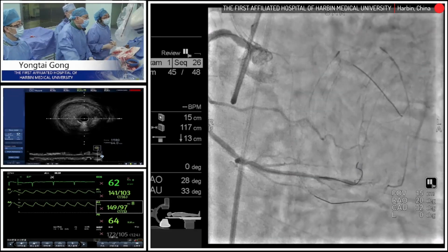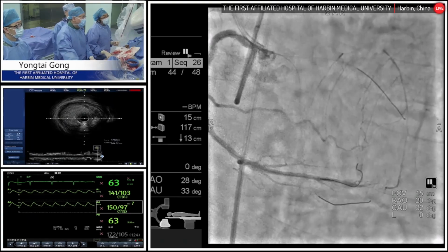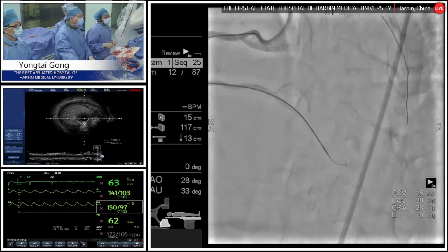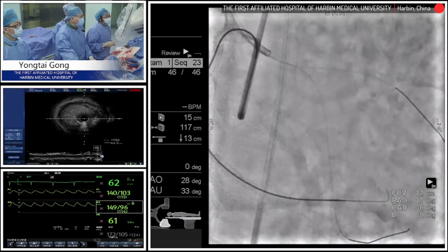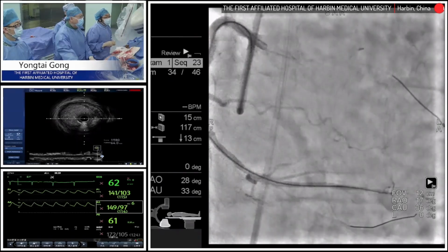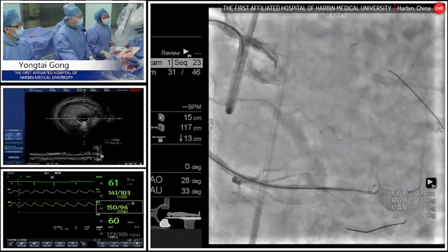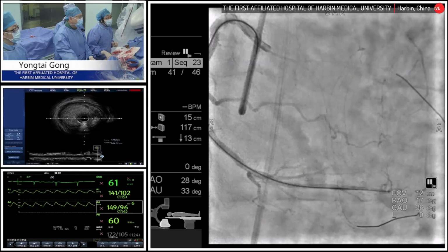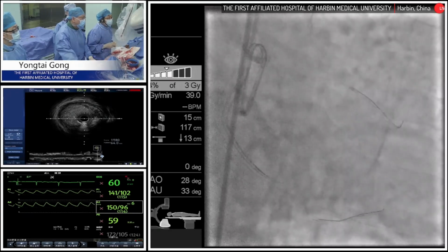So you think the one proximal to this choice? But the proximal septal branch is close to the distal cap of the CTO segment. So you need to make a very sharp turn after you go through the septal branch, which is a relatively difficult choice, very complex. Okay, I will try.